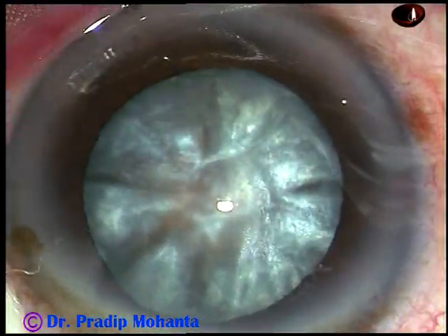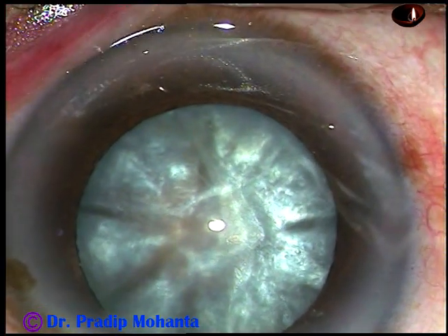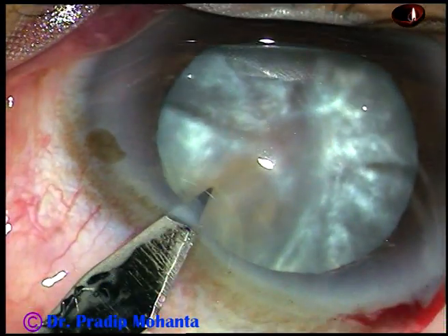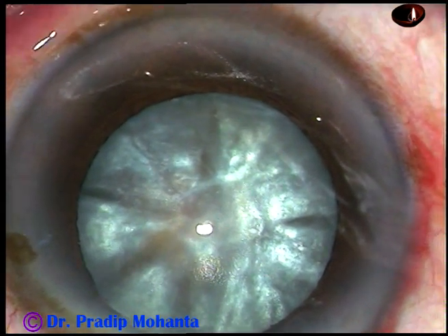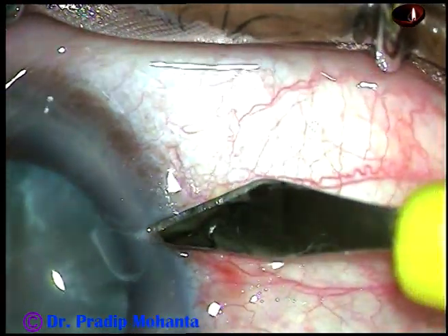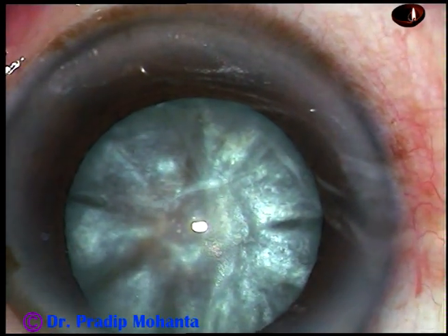This is the main incision on the posterior aspect of the limbus. And now this is a paracentesis on the left side of the main incision, about two and a half clock hours away. And this is one more paracentesis on the right side of the main incision, about three clock hours away.